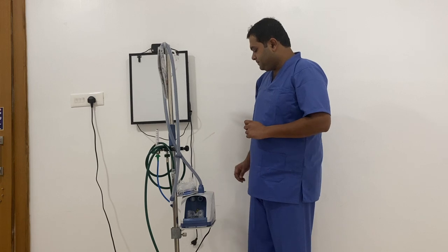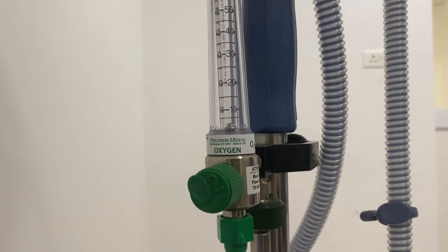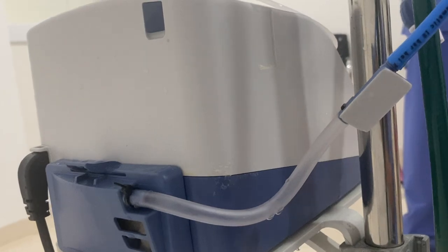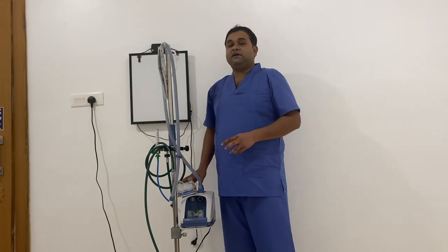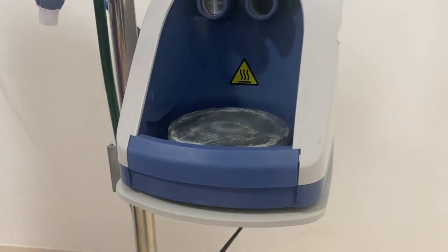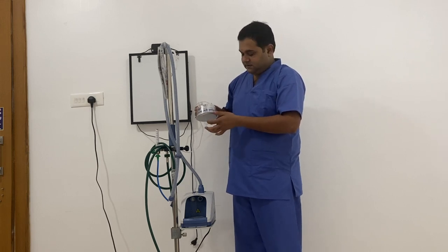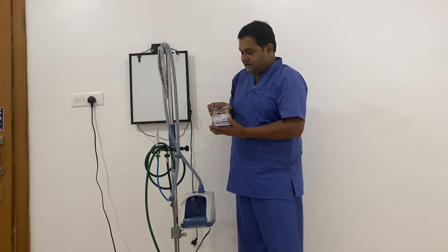Coming to the mechanism: the gas flow is delivered from the oxygen pipeline to the flow meter. The oxygen passes through this tubing to the humidifier. From this port, the oxygen is delivered to the water chamber. Here the gas flow gets humidified and heated up to a desired temperature because of this silver plate. This plate heats the water present in this water channel.